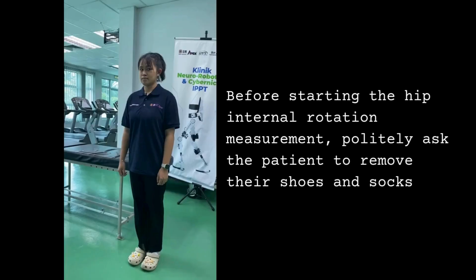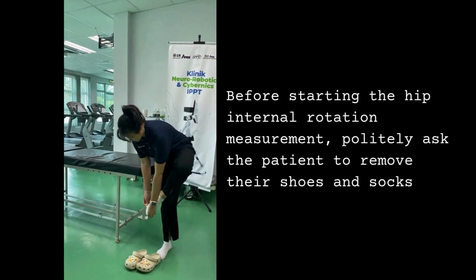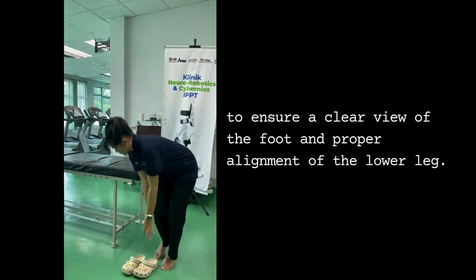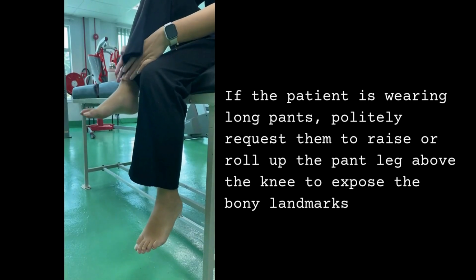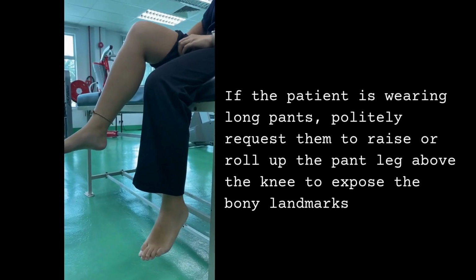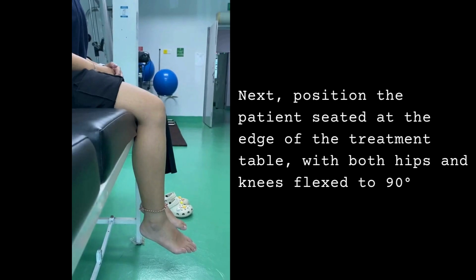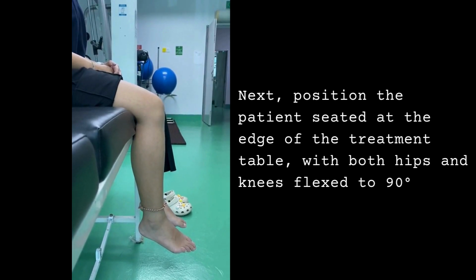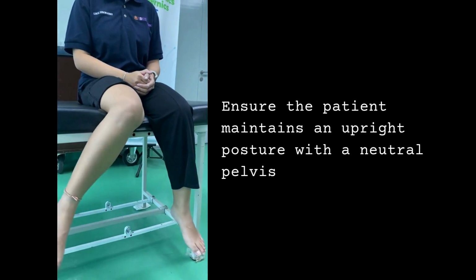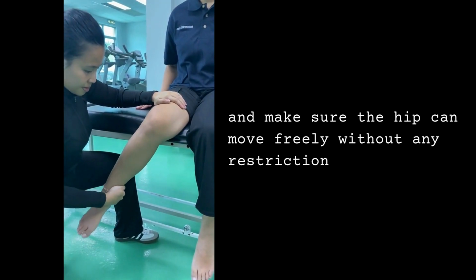function. Before starting the hip internal rotation measurement, politely ask the patient to remove their shoes and socks to ensure a clear view of the foot and proper alignment of the lower leg. If the patient is wearing long pants, politely request them to raise or roll up the pant leg above the knee to expose the bony landmarks. Next, position the patient seated at the edge of the bed with both hips and knees flexed to 90 degrees. Ensure the patient maintains an upright posture with a neutral pelvis, and make sure the hip can move freely without any restriction.